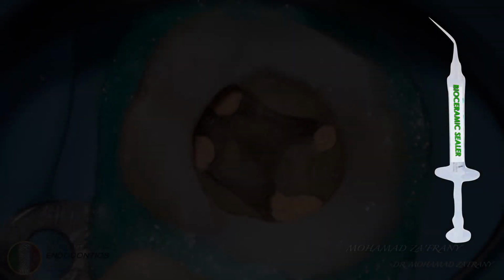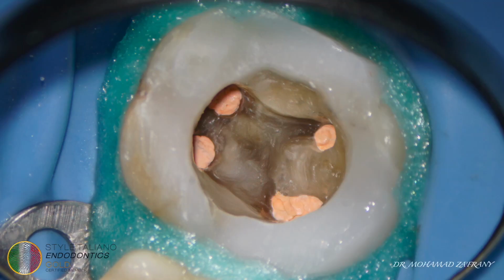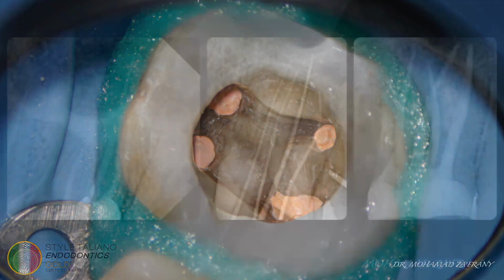And here is the case after obturation and filling of the canals. And this is the radiographic workflow.